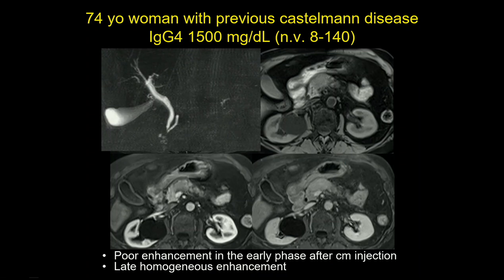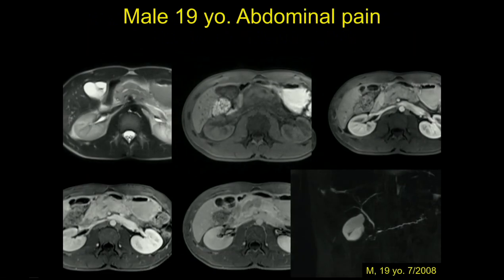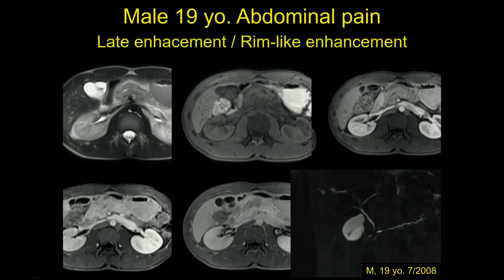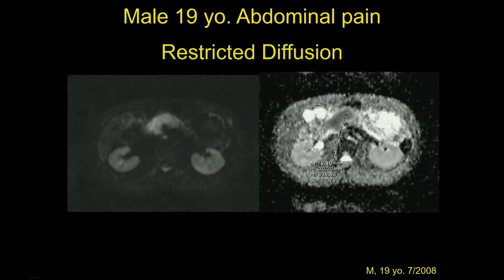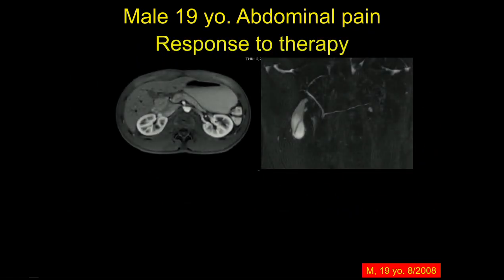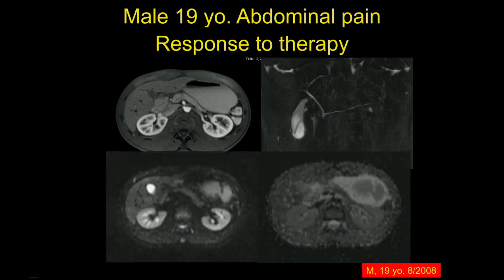In the same patient, there was long narrowing of the main pancreatic duct without significant upstream dilatation. In a young male with abdominal pain, a focal mass with peripancreatic rim enhancement and diffuse Wirsung duct dilatation without significant upstream dilatation — diffuse stenosis without significant upstream dilatation — with highly restricted diffusion. DWI is an important biomarker to differentiate the acute phase from the post-acute phase and response to therapy. After one month of steroids, the pancreas reverts to almost normal, and diffusion also normalizes.